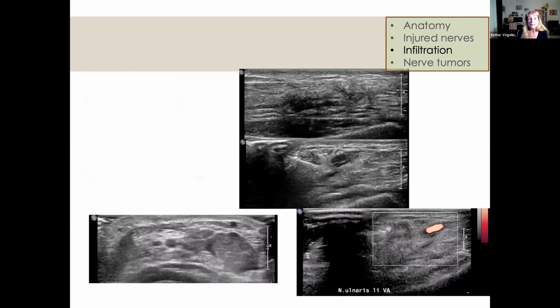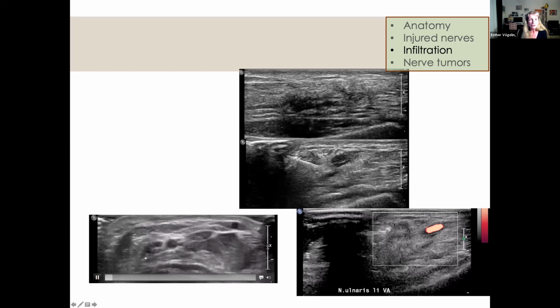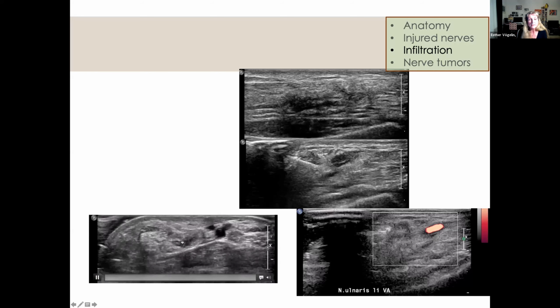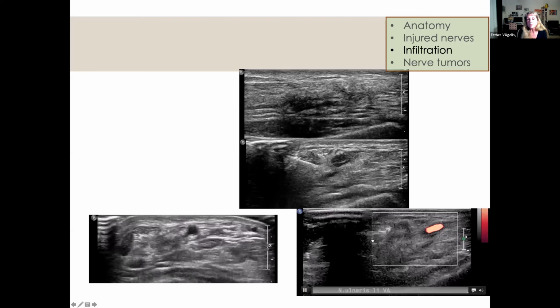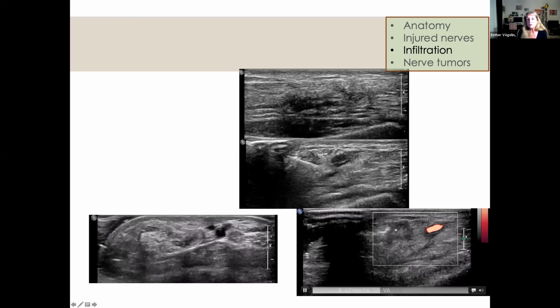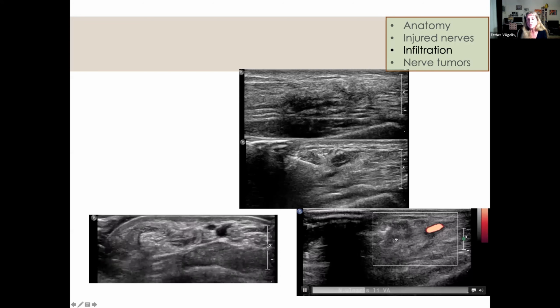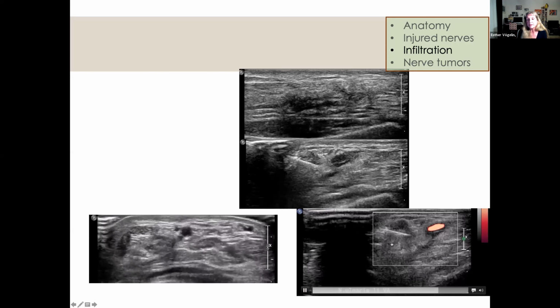So you see here the ultrasonography. This is the ulnar nerve. Here was the neuroma. You see here the needle. This is the ulnar nerve. And we actually do an infiltration of the ulnar nerve proximal of this zone to get more information. You see here in the cross-sectional area, here is the nerve graft distally, and then you place your needle proximal to it, proximal to the nerve graft. And here is already your infiltration of your local anesthesia. This is the ulnar artery. Here is the ulnar nerve.